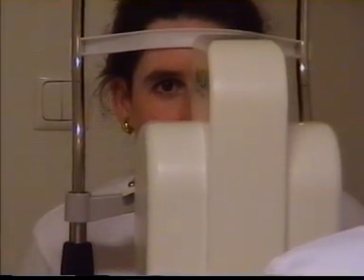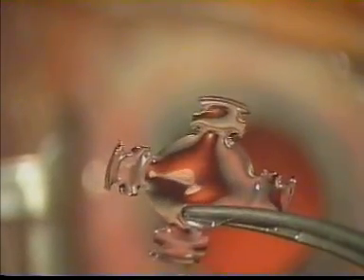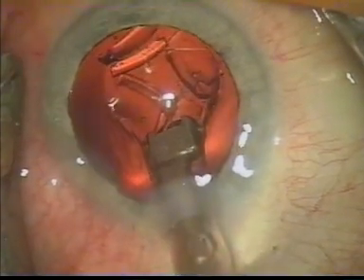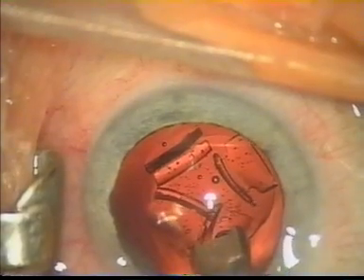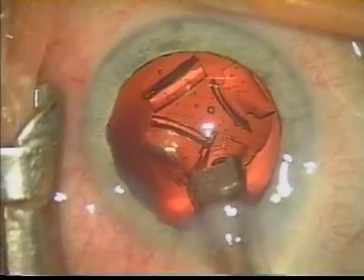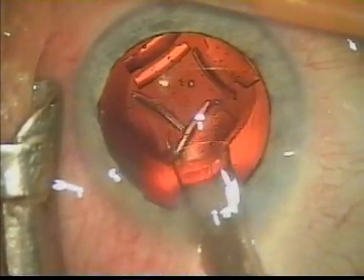For the first time, changes in refraction as well as in aberration were objectively and automatically measured in pseudophakic eyes. Information on the change in the overall wavefront aberration as well as the individual aberration was obtained. Some of the aberrations arise from a slight distortion of the IOL due to the process of accommodation. Systematic changes in spherical aberration and variable changes in coma with increasing accommodation are consistent with the motion of the IOL during accommodation.